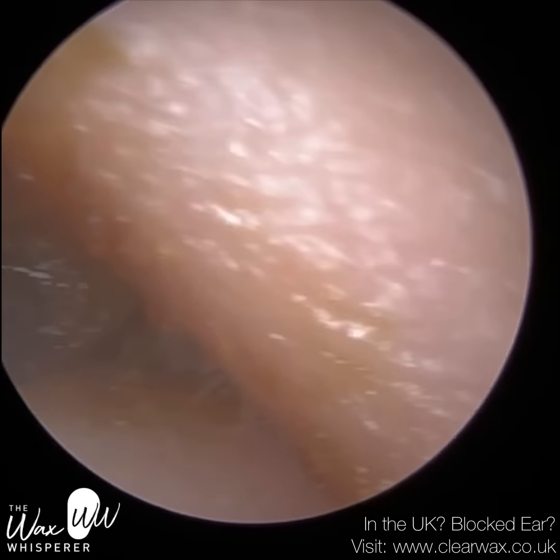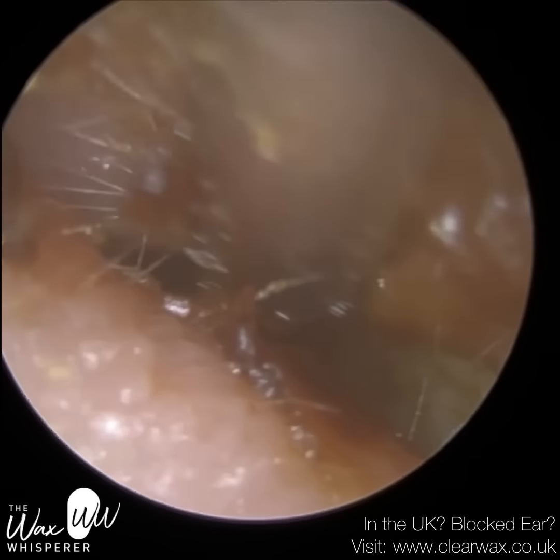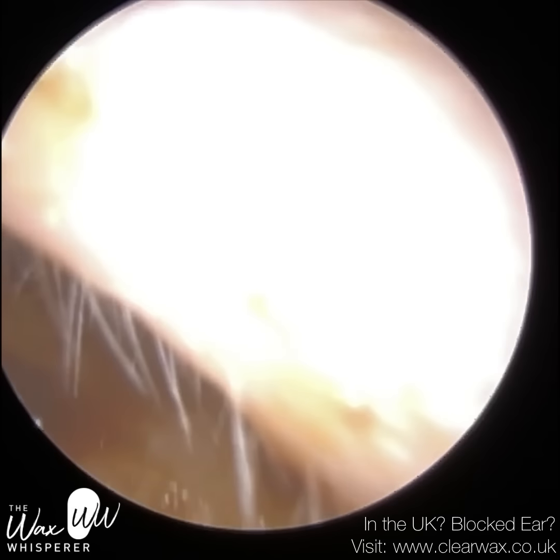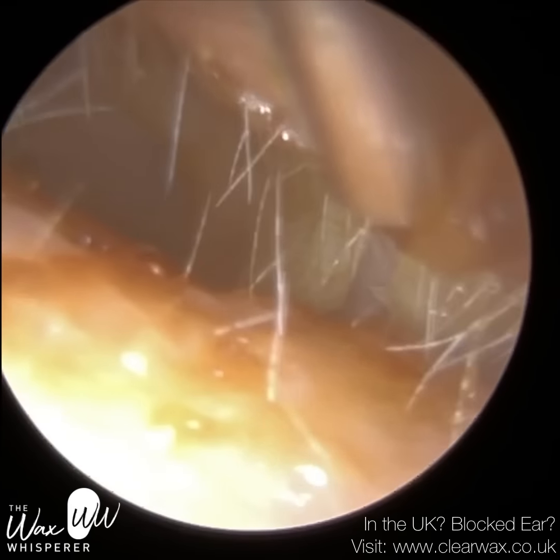At first I struggled to get the instrument in, but as you can see we're making good headway now. I've removed all the occluding wax and dead skin already, and I'm just going to enter the ear after mopping up some of this sticky wax that stained the front section of the ear canal.